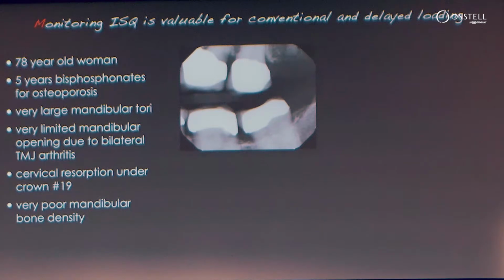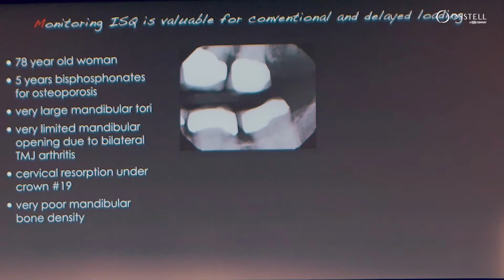Well, let me illustrate a case here and show you how the synthesis of the carpentry and the biology comes together, and how an Osstell, or understanding the ISQ, helps us make decisions. This is a patient who's been in my practice a long time.